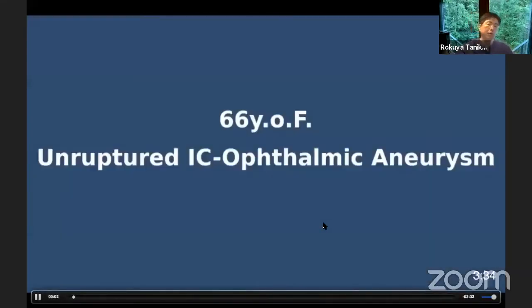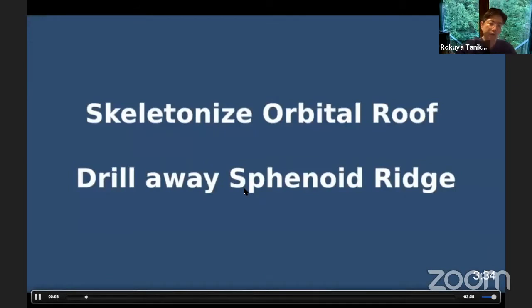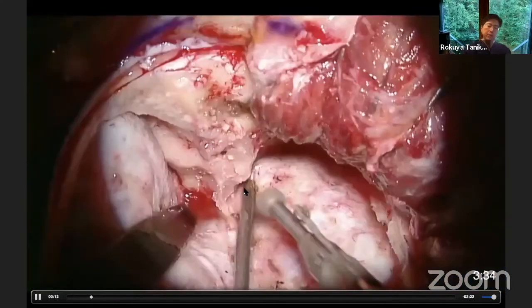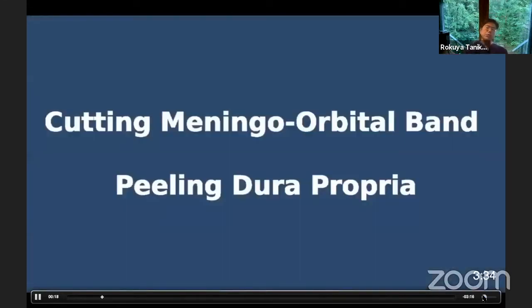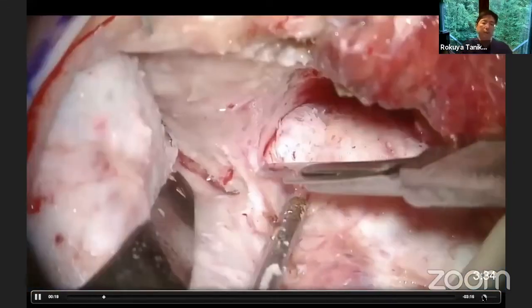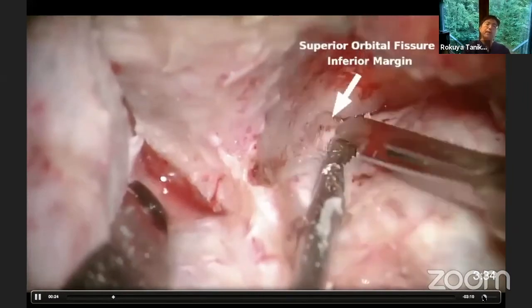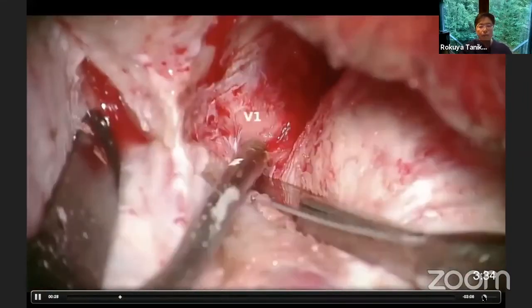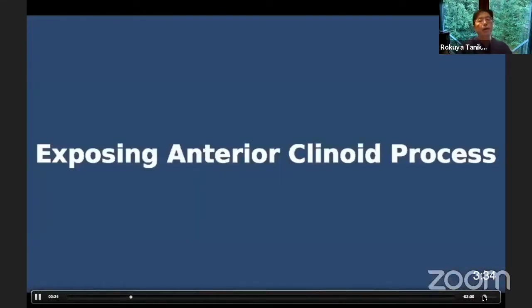I'll show you an actual case of anterior clinoidectomy — a 66-year-old patient with a right-side paraclinoid aneurysm, a small one. This is a right frontotemporal craniotomy. After the craniotomy, you can start drilling the optic orbit like this, then you can incise the superior orbital fissure. With meticulous hemostasis and exposing the cavernous lateral wall, you can recognize V1.